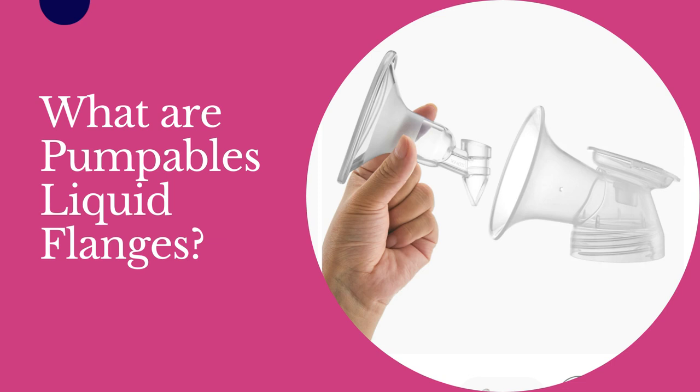Pumpable's liquid flanges are a combination flange setup that combines the structure of a hard plastic shell with a silicone insert that is attached to the duckbill valve. This allows the silicone insert to collapse around the nipple and areola, which can increase stimulation, increase the speed of milk removal, and if they fit you well, are known for being exceptionally comfortable.